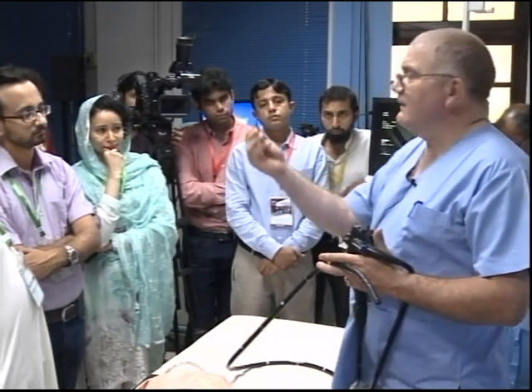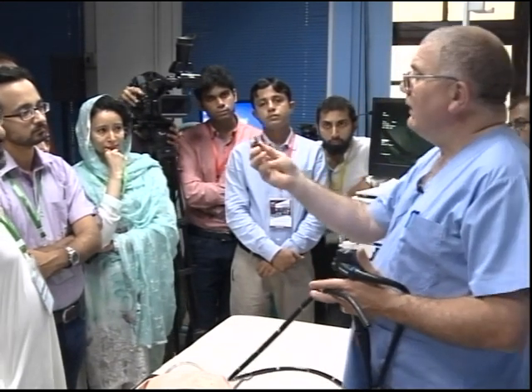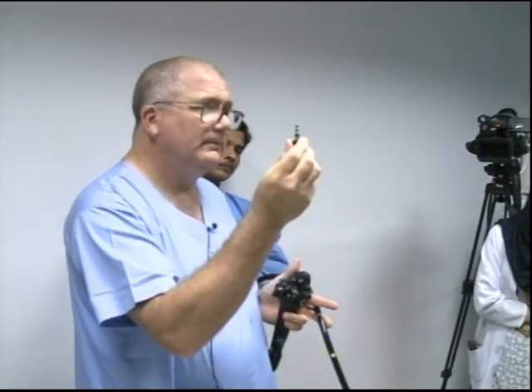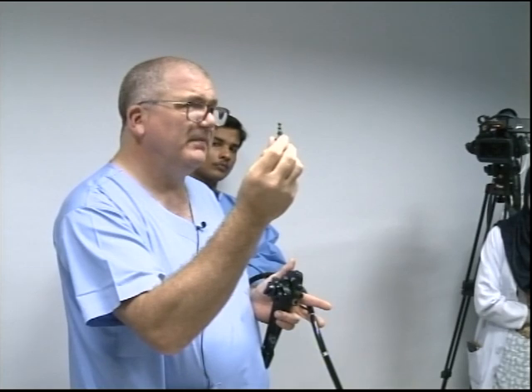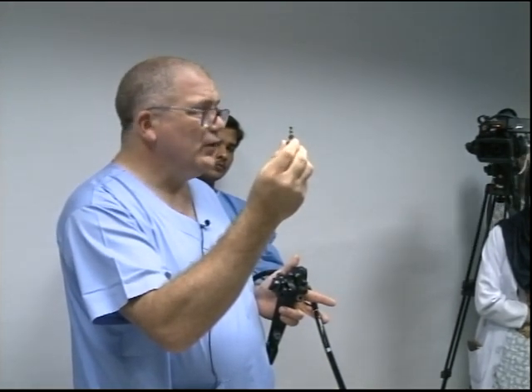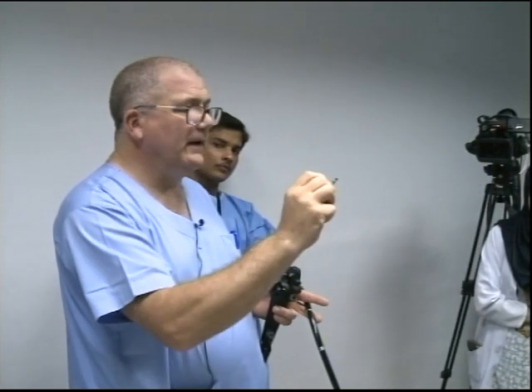The problem is that the rubbers on the actual button become stiff. Why do they become stiff and even split? Split because you keep putting them in and out, but why do they become stiff? Not silicon oil. Why do they become stiff over time? This is a brand new scope, so that's nice and soft. Yeah. Okay? But why do they become stiff? Friction problem. No.